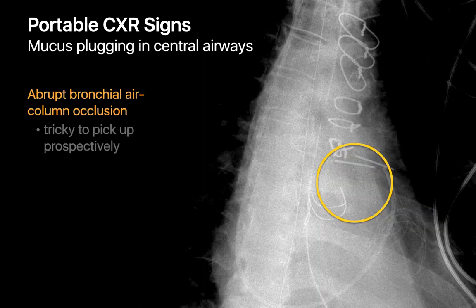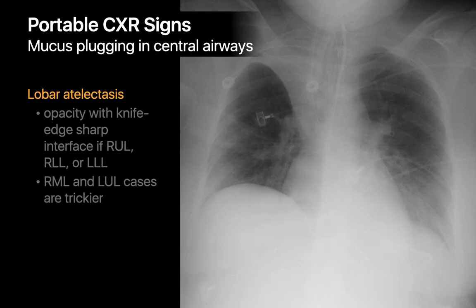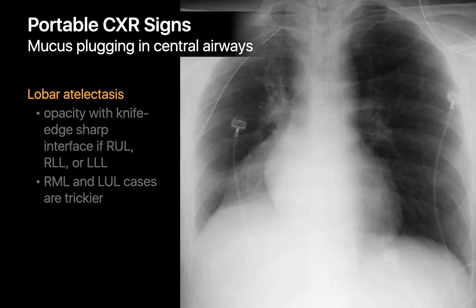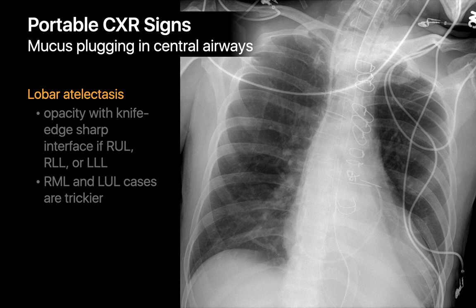With mucus plugging in the central airways, abrupt cutoff of the bronchial air column might be visible, but tends to be challenging to pick up prospectively, particularly on portable chest x-rays where technique may not be ideal. You're much more likely to detect mucus plugging by recognizing obstructive lobar atelectasis. Right upper, right lower, and left lower lobar obstructive atelectasis are the easiest to identify — look for a homogeneous region of densely opacified lung with a sharp knife-edge interface, as seen in cases of right upper, right lower, and left lower lobar atelectasis.